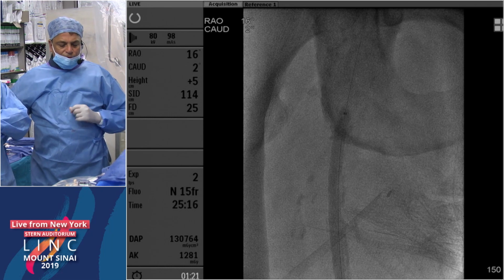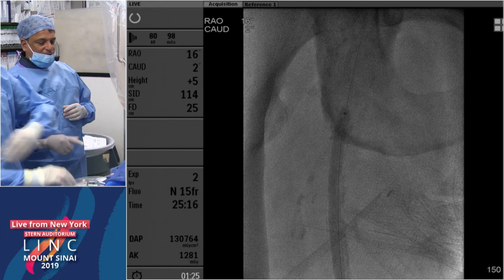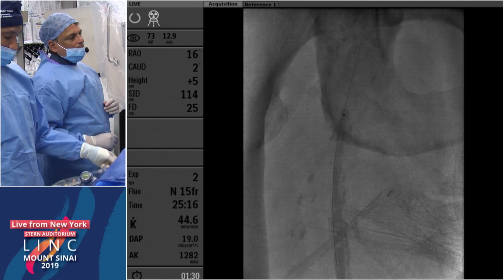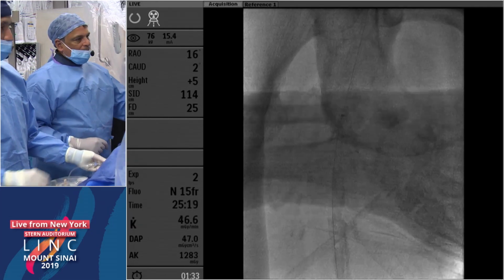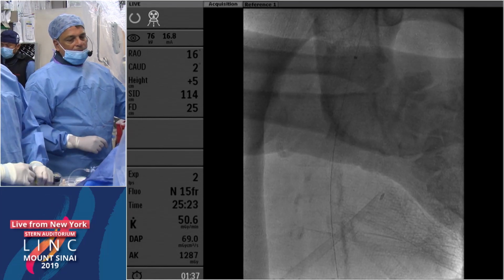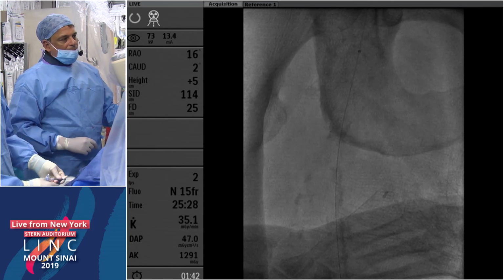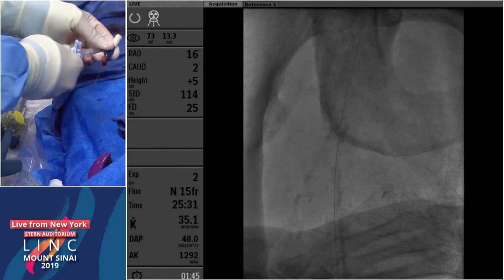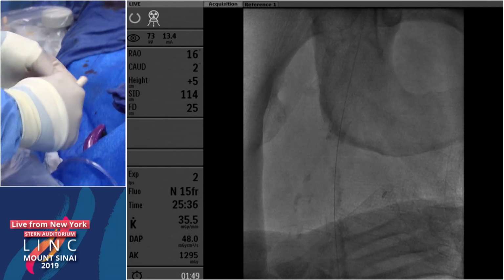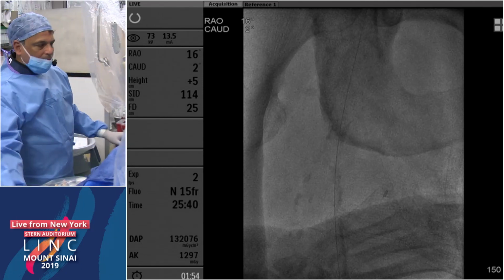But how do you treat the perforation? I know nobody likes a perf. Would you have stented this, Mike, with a covered stent with the size of perf that you had there? Yeah, you know, in a live case, you're under a fair amount of pressure. When you have greater time, in a more relaxed atmosphere and not everybody's watching, you could put a balloon up and leave it up for a longer period of time. If I had a reasonable result without extravasation of contrast after a more prolonged period of balloon inflation, I might have left it alone.